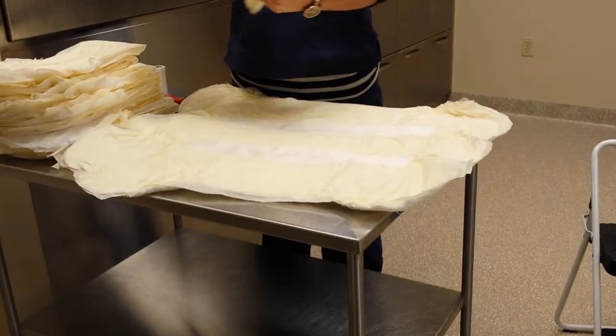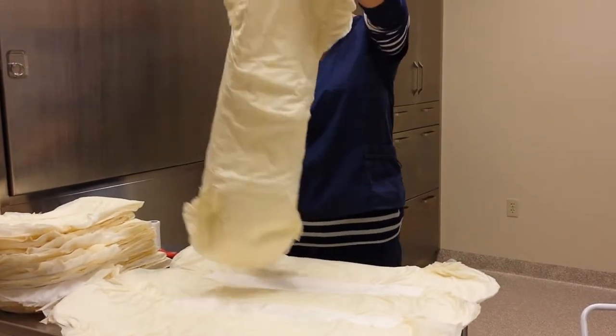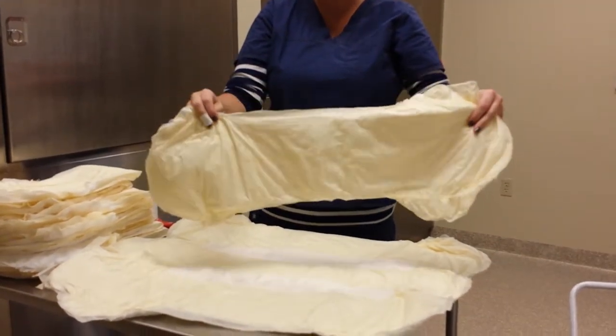We're going to start out by making leg dressing. You want to take a diaper, lay it out flat. We've cut around the edges here to make it so it's not bunched up. Basically what you can do is you can take one to three pieces depending on the length of your leg.